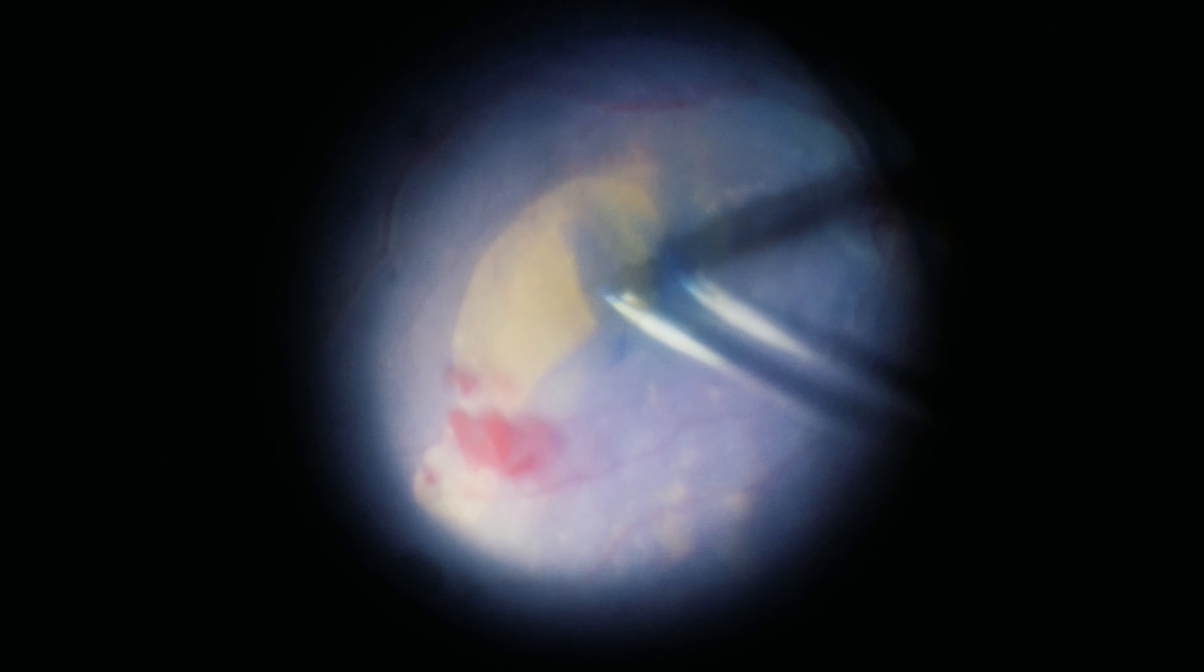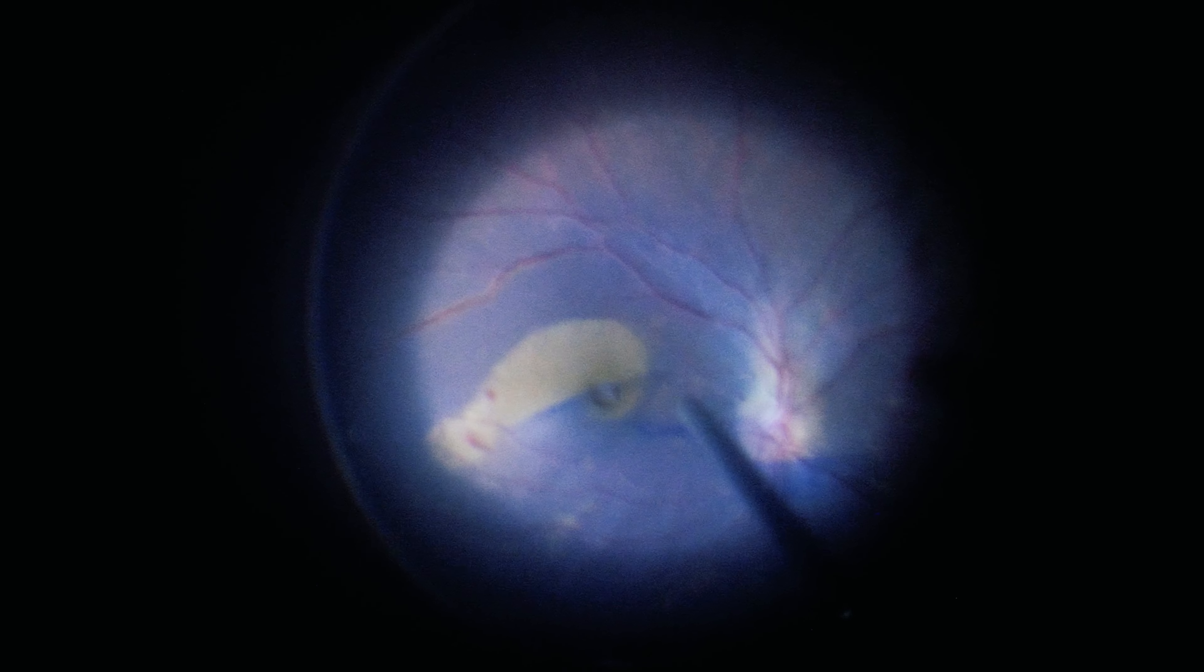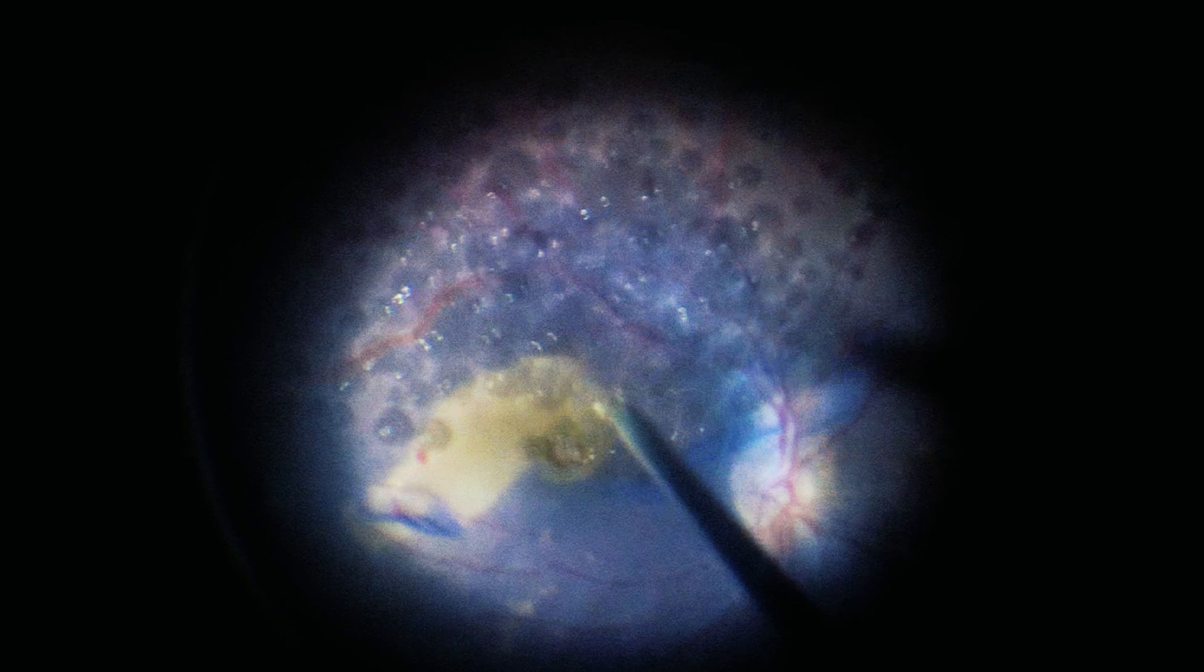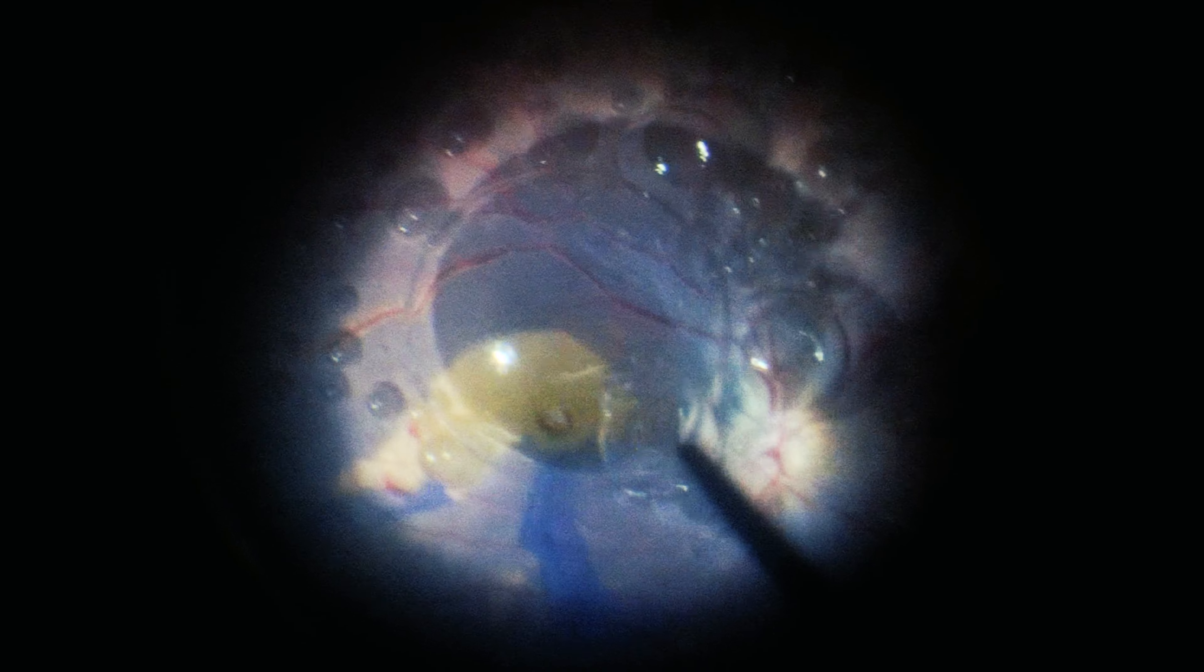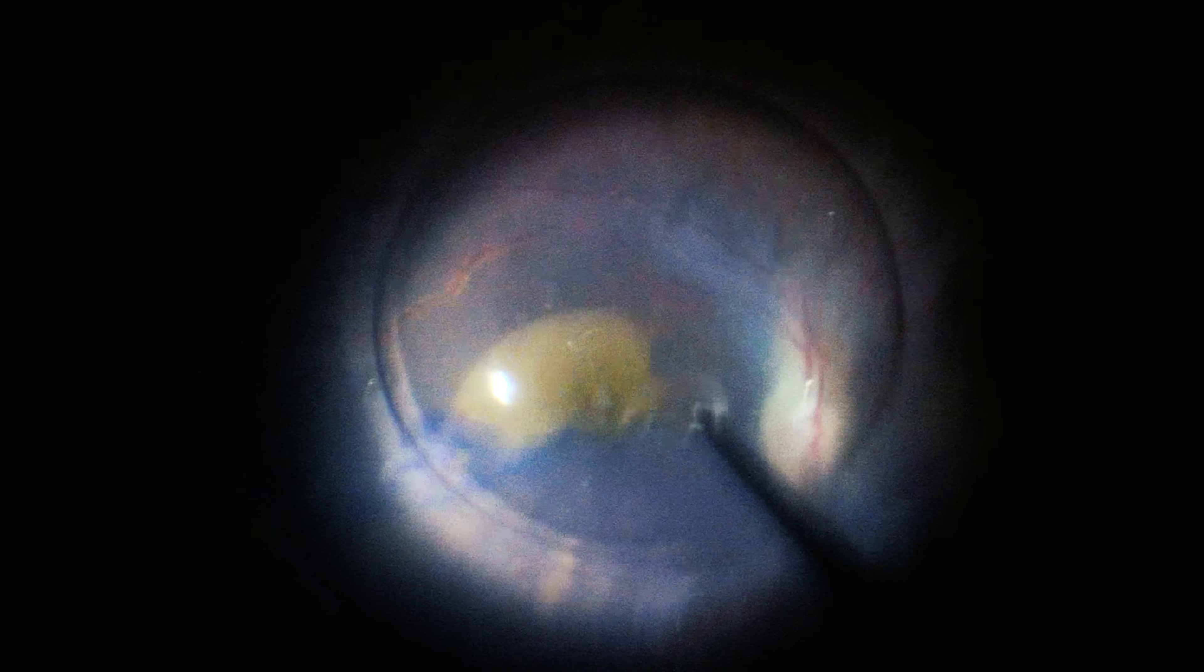That could probably be traumatic with trying to put it back into the hole with the same technique. So another approach had to be thought of. PFC, perfluorocarbon liquid, which is heavy and has a high surface tension, was put on the macular area in an attempt to hold the ILM firm around the foveal area.